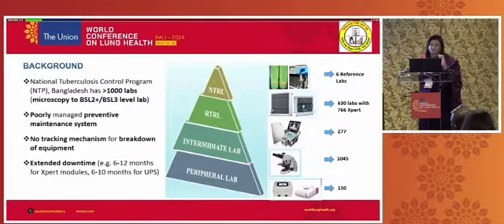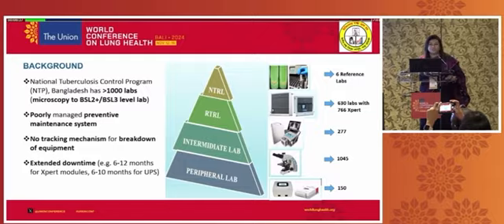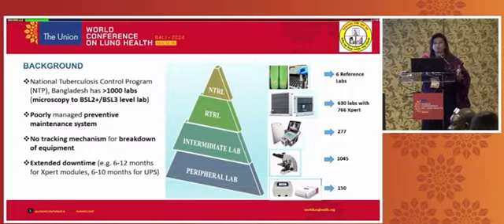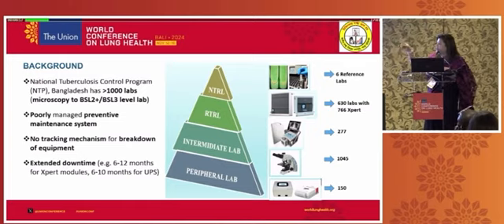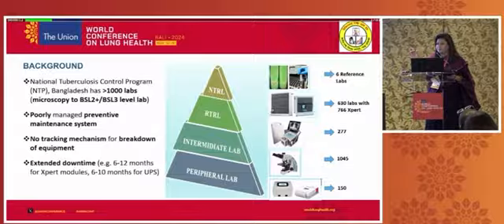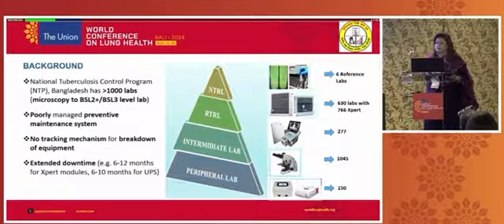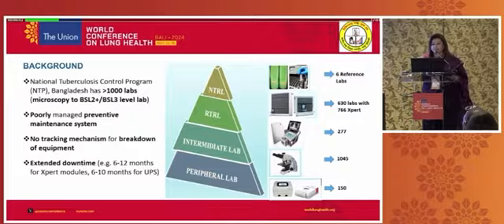In Bangladesh, we have more than 1,000 laboratories, including microscopes, GeneXpert, TrueNet, X-ray, and culture systems, BSL-2+, even BSL-3 level laboratories. Here you can see the laboratory hierarchy of our TB diagnostic network, where at the top we have the national reference lab, and below that the regional reference lab. These reference labs have all the capacities of TB diagnostics presently in our country for the diagnosis of TB.